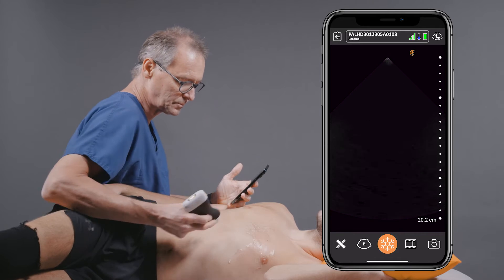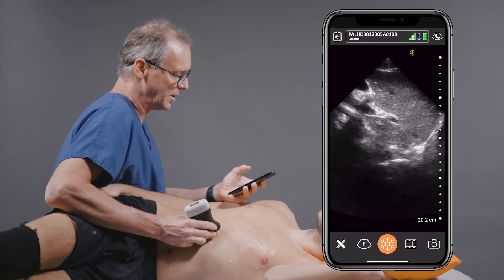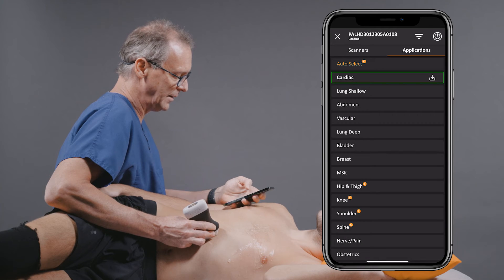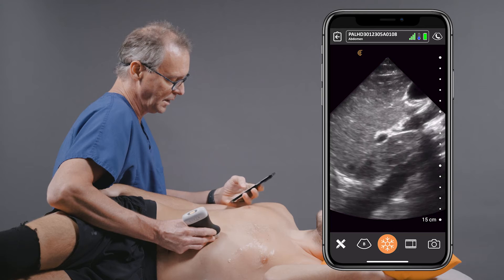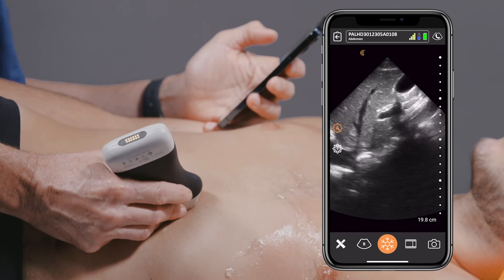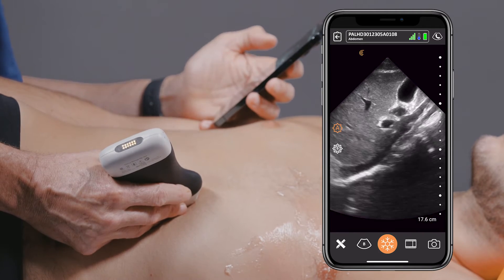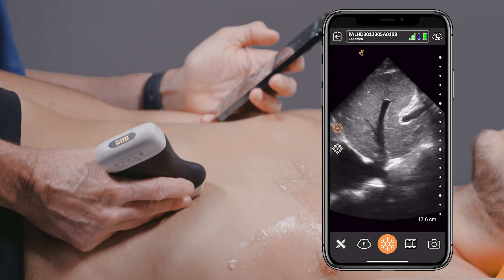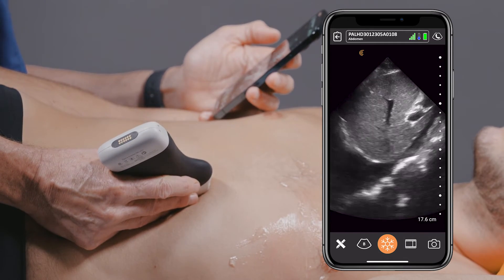From here, we'll move down into the subcostal area. We're going to flip our preset over to abdomen and examine the inferior vena cava. You can see it very clearly here — beautiful image quality. You can see the inferior vena cava as it goes all the way down into the right atrium.